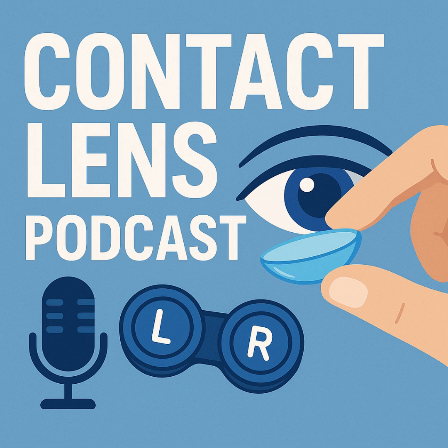Okay. And the really crucial part is that it has to stay put in the right orientation. Unlike a spherical one, you can just pop in. Precisely. If a toric lens rotates even a little bit, your vision can get blurry, just like that. I've heard people mention that their lens is spinning. How do manufacturers stop that?